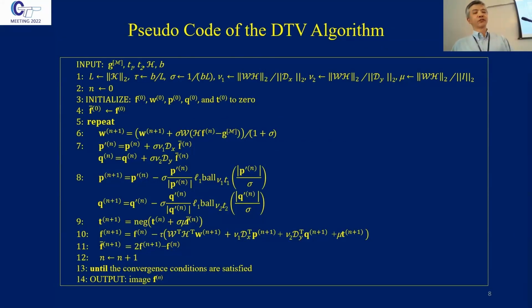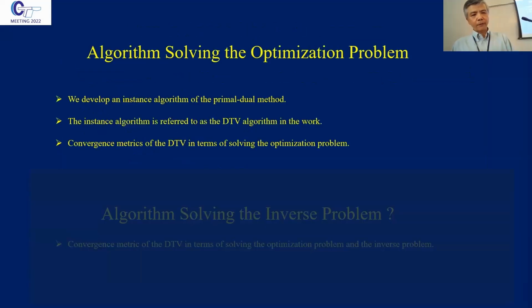This is the algorithm, the pseudocode for the algorithm. I'm not going to get into details. It's pretty much standard now. So basically you have an iterative algorithm. So we derived it.